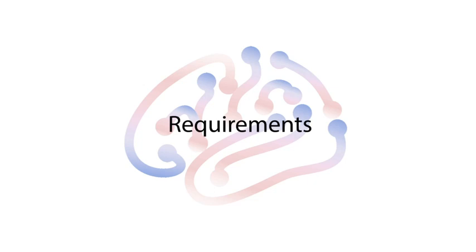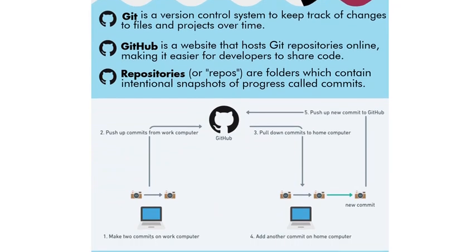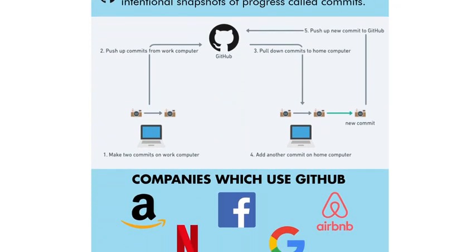There are also requirements to run DSI Studio Cloud. You would need to have a GitHub account. It is free, unless you would like to use some paid resources.